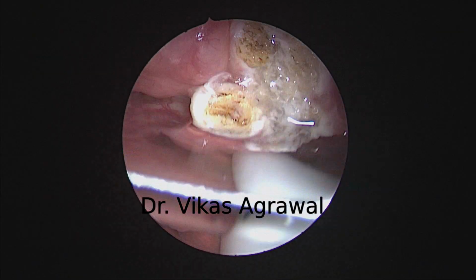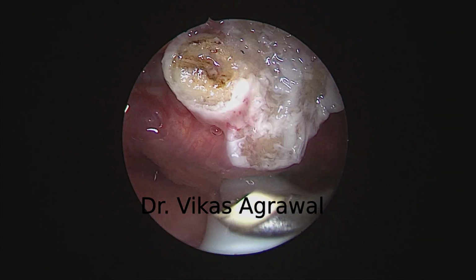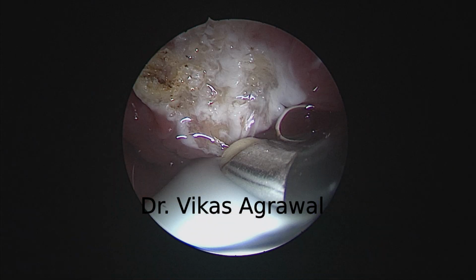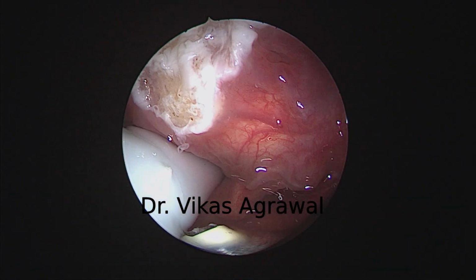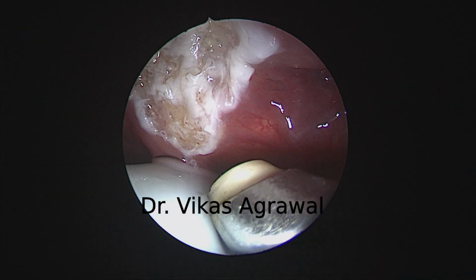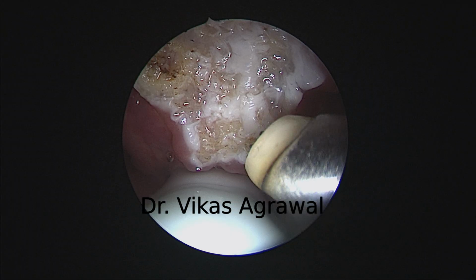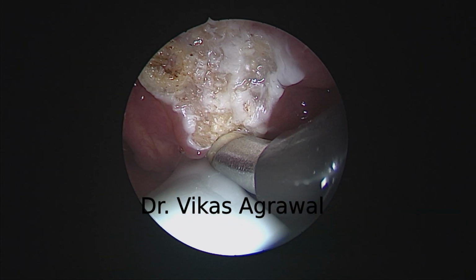Now see, be extremely careful, because if you open up any vessel, alright, now what I am doing is, see, this is the lateral glossoepiglottic ligament and the vessel. I am just coagulating. I am not ablating at all. And I am restricting myself to midline. I am following the tube.